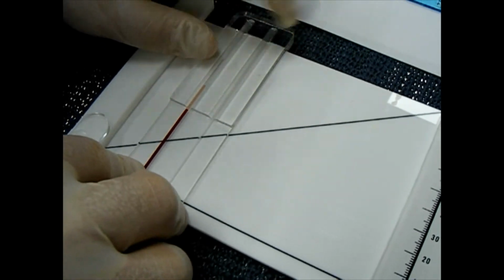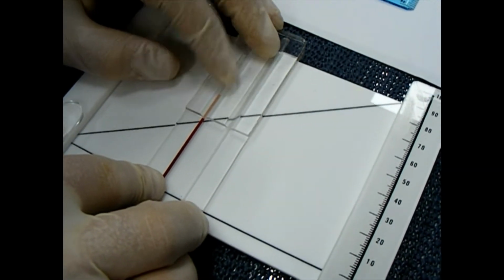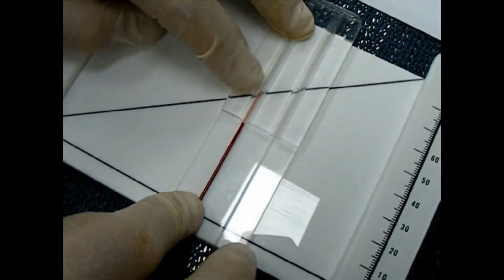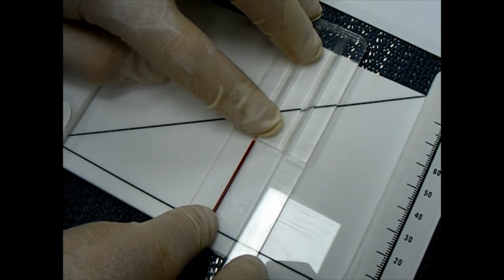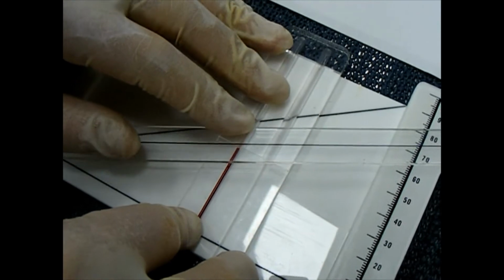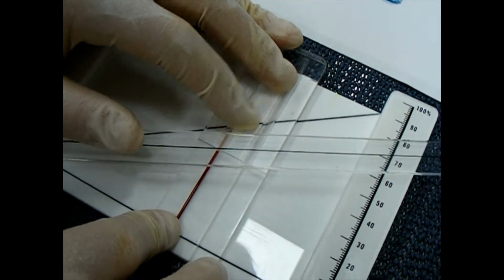And then you hold it in place, you slide it along, so this black line is on the top of the plasma. So they're the two things we measured with the manual. So they're the two places you need to line this up. Then after you've done that, you bring this second arm in place. You go right on top of, sorry, I'm just moving that a little bit.